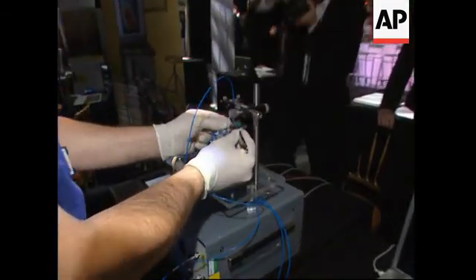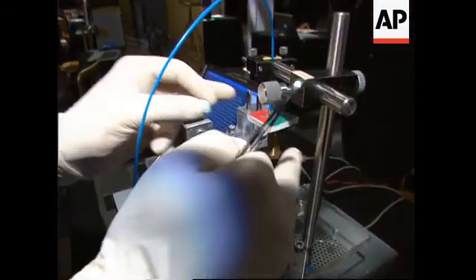So we just place it over here. So after I have identified that lymph gland, I take it out of the patient, I biopsy that lymph gland, and then divide it into two and bivalve it. And then we have designed and developed this optical scanner that actually scans the whole surface of the lymph gland, and the signal we get from cancer is different from the signal we get from non-cancer.